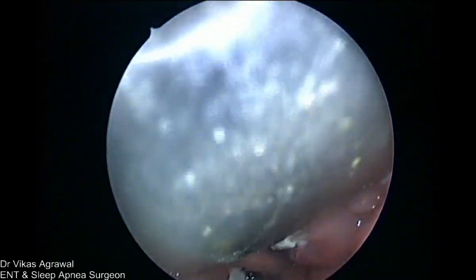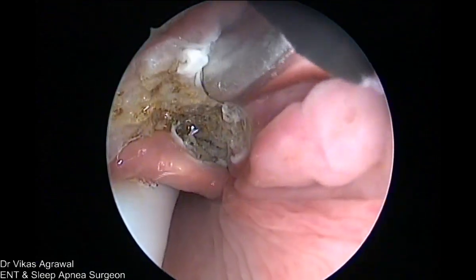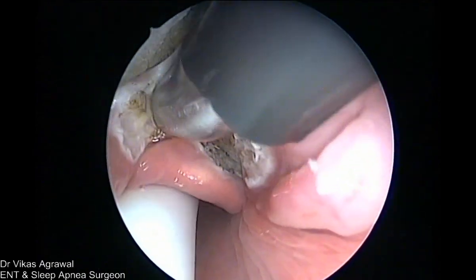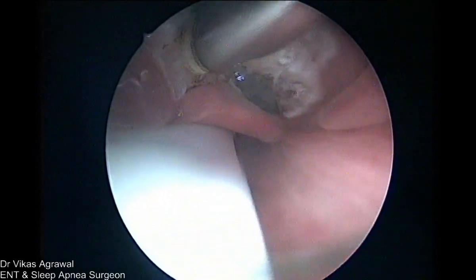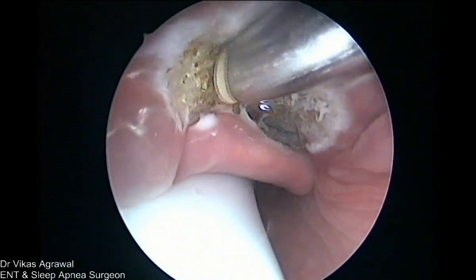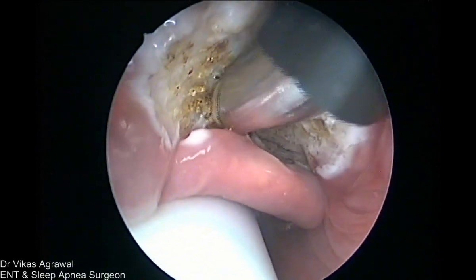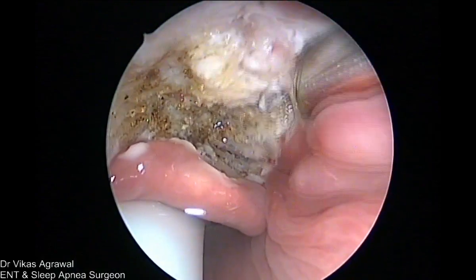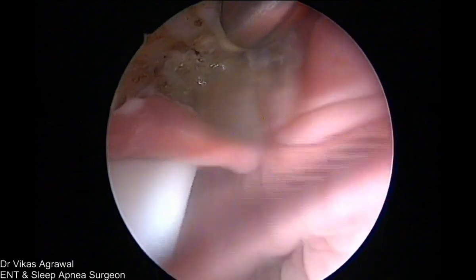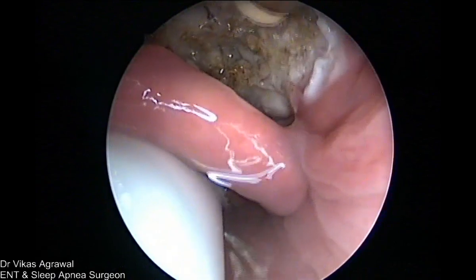Now I'll come on to the left side. Maybe a little more coagulation of this will help. But actually this is not the area which causes sleep apnea. The area that causes sleep apnea is here. Maybe I can just do a little more midline dissection into the muscle. And this you can just coagulate, because these are lymphoid tissue. Once you coagulate, they will fibrose. This is not the critical area. The critical area was in the midline.